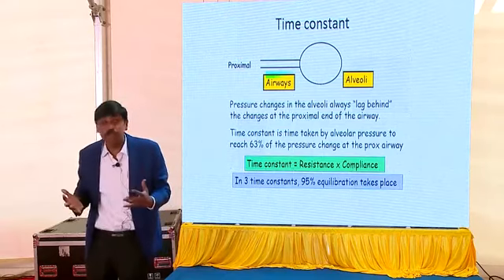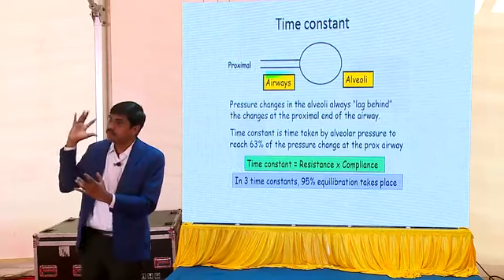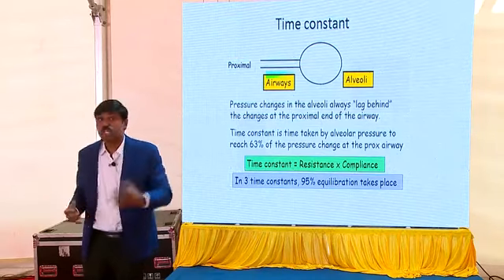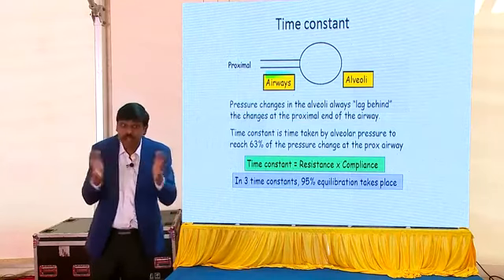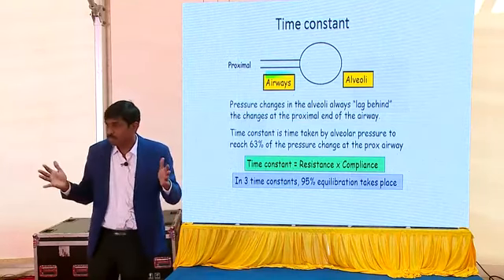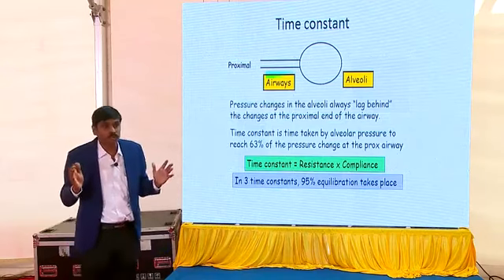When it's meconium aspiration syndrome, it's a mix of both. Your alveoli are again going to be stiff because the meconium has damaged the lungs because of pneumonitis, and again your airways are blocked by it. So here you give somewhere in the middle. That's how you decide the inspiratory time you're going to give, and the rate also.